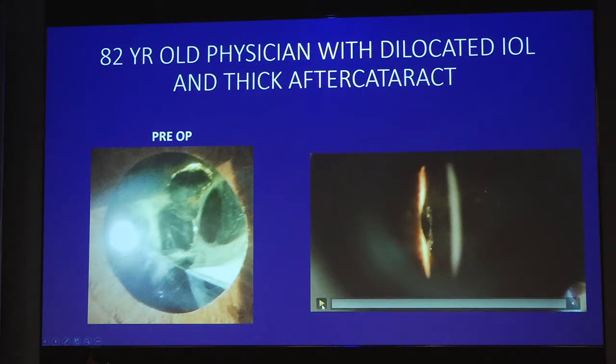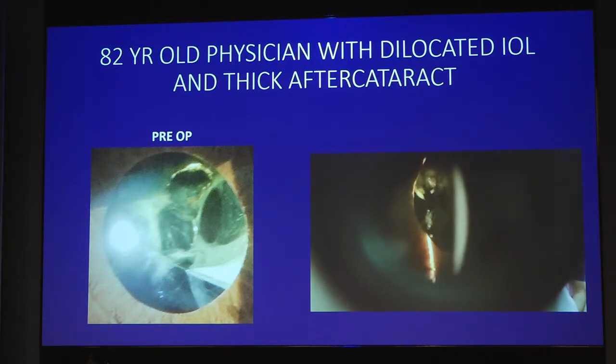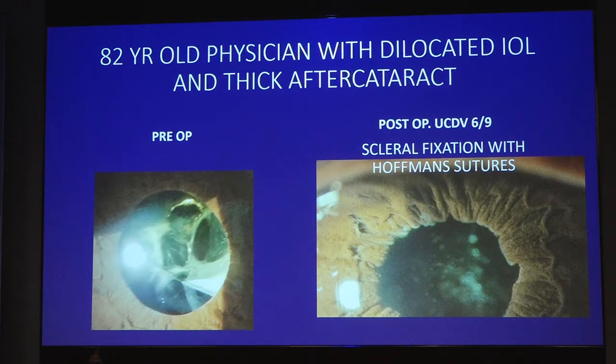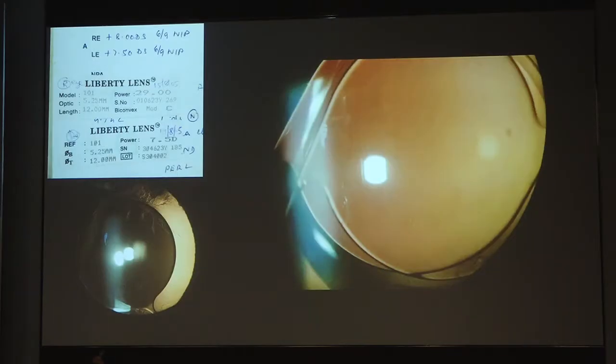And here you can see that he has a little bit of vitreous peeping through the small PCR here, and the previous surgeon has put a nice lens in the eye, but he has severe fibrosis and upward dislocation. So in this particular patient, I removed the lens, did an anterior vitrectomy, and then did a scleral fixated lens using a standard calculation. And here you can see the scar of the Hoffman pocket, which was created. And the iris hooks were used, so the pupil has become a little larger, but basically he got 6/9 uncorrected and is reasonably happy.